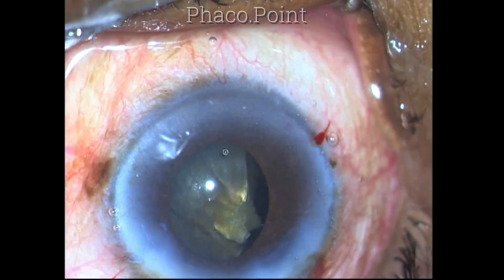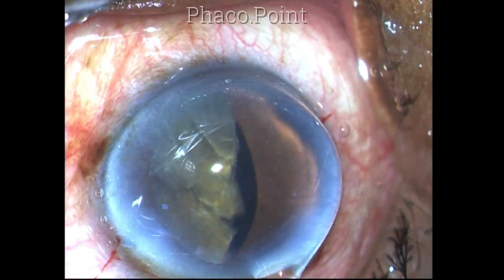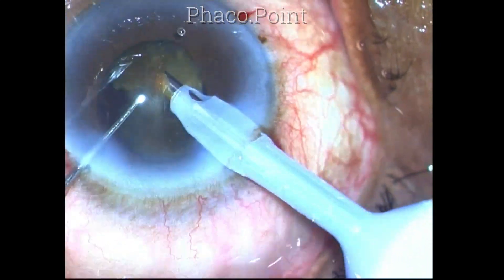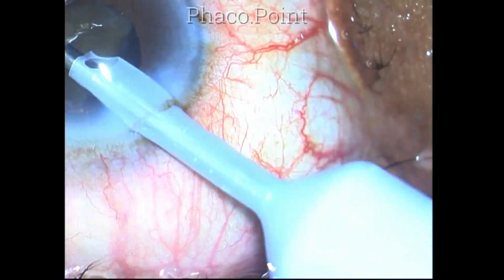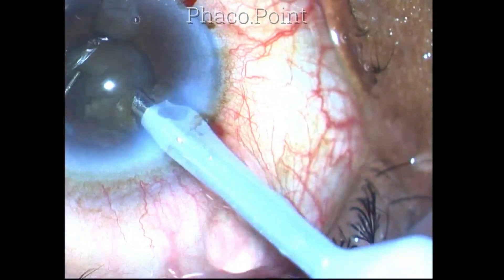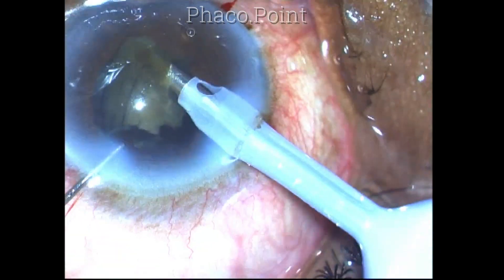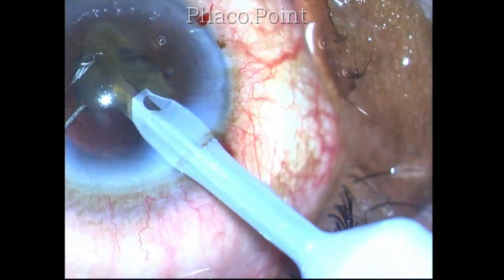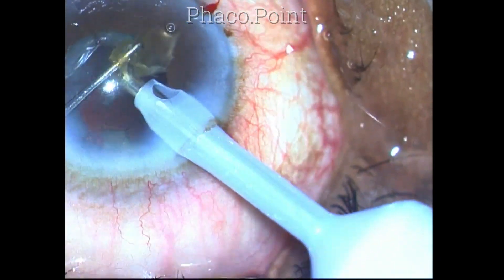We are now moving towards the final pieces of the nucleus, so once again a top-up with 2% methylcellulose. I do not reduce the settings for the last piece. This is because I have a dual linear foot pedal system where I can reduce the vacuum on the fly for the same phaco power.